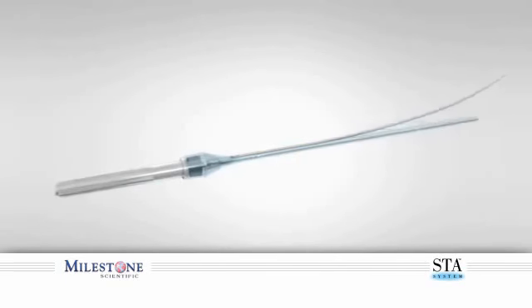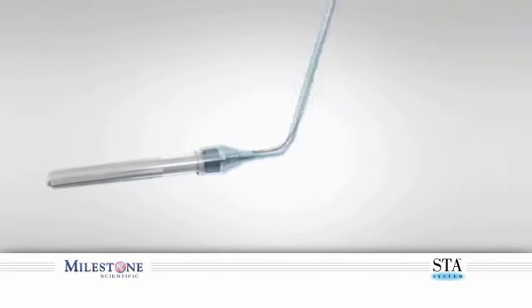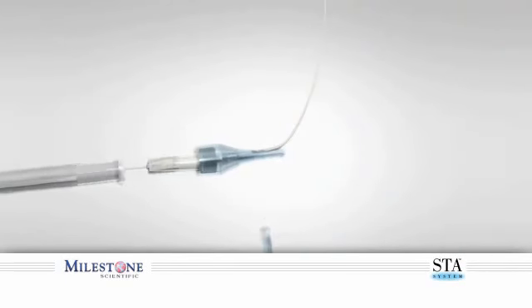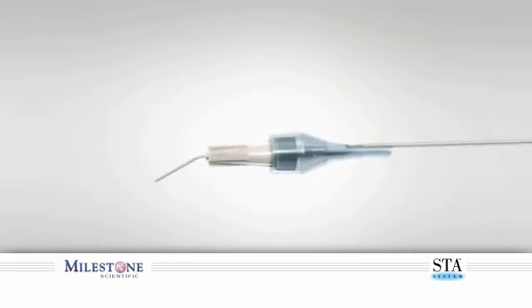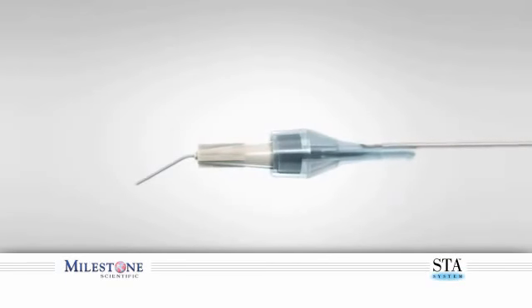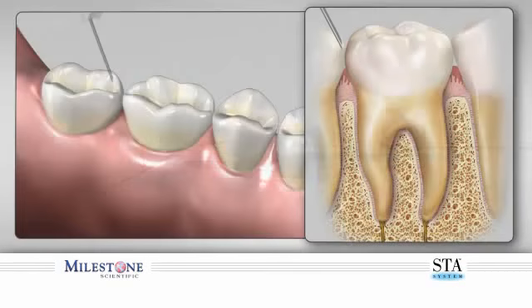To improve accessibility in difficult areas, shorten the STA handpiece by breaking off a section of the handle. It may also be necessary to bend the needle for proper needle placement. Bend the needle no more than 45 degrees. Bending the needle bevel toward the handpiece allows easier access to the distal root of mandibular molars. The needle bevel should face the root surface during needle entry into the sulcus.